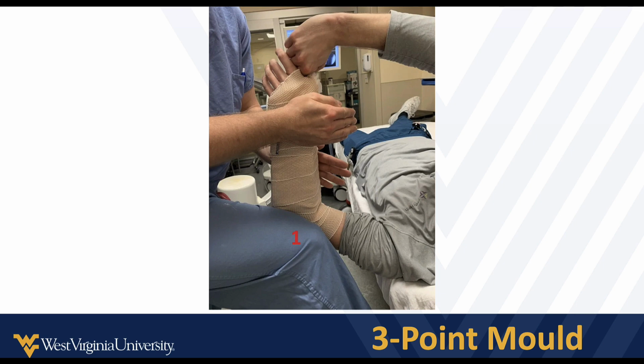So you see, highlighted here, the 3 points. We've got the knee on the back of the elbow, a hand right at the fracture site, or very close to it, and then we're applying some pressure. Typically we like to have them a little bit flexed and ulnar deviated if possible. My one little quibble with this is, you'll notice this elbow needs to be at a better 90-degree angle. If I see you splint like this as one of my trainees, I will yell at you and complain. Their elbow needs to be at a very firm 90-degree bend when you place the splint.